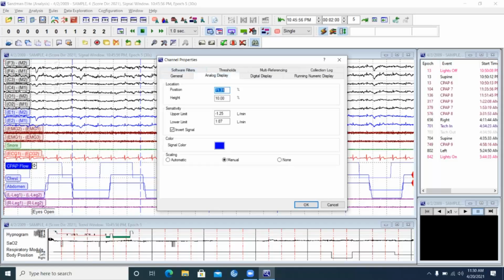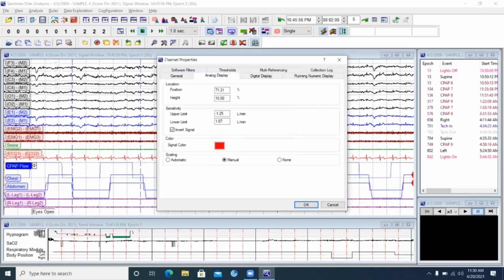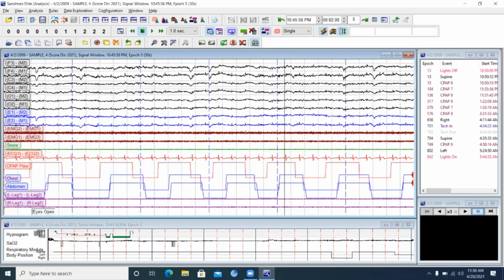What kind of artifact is that in our respiratory channels? No. What happens when it gets like that? Yeah, squaring off, which means what? Not electrode popping. Yep, pen blocking or squaring off.